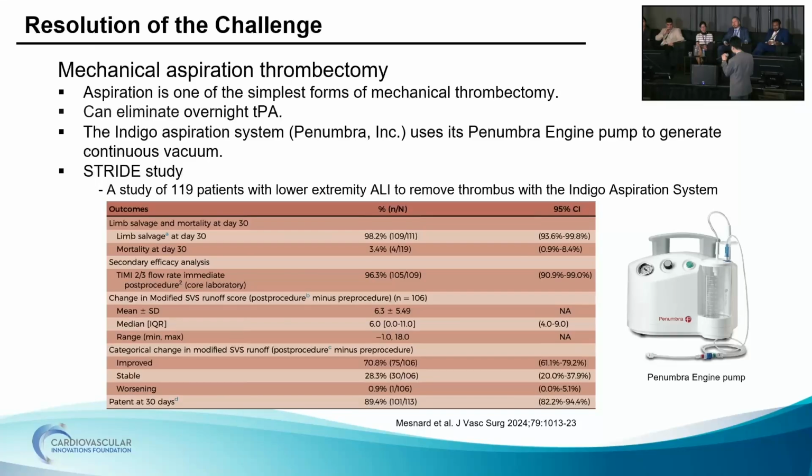Yeah, so the patient has an obturator bypass. Getting into the abdomen is of course not easy because of the redo abdomen, and because the bypass is tunneled through the pelvis, getting access at that point is also very challenging. So the access point we selected is where it's shallow, the distal anastomosis area, where it's quite shallow for us to access.